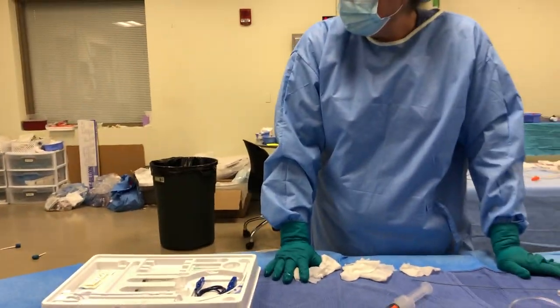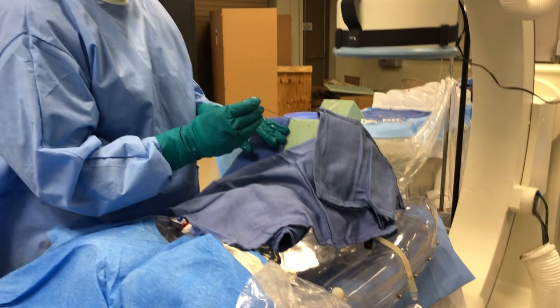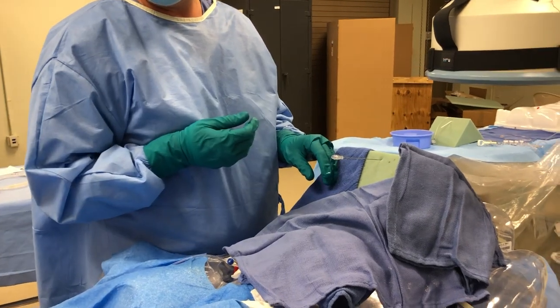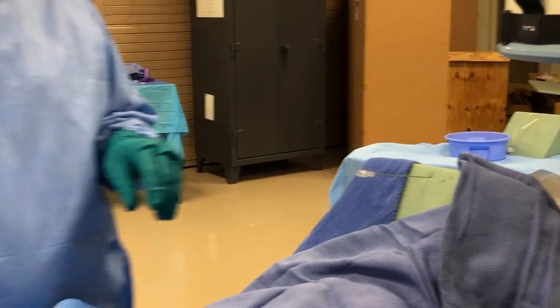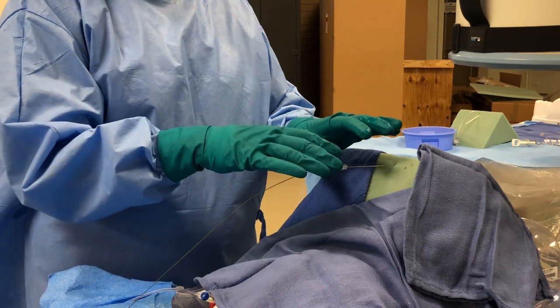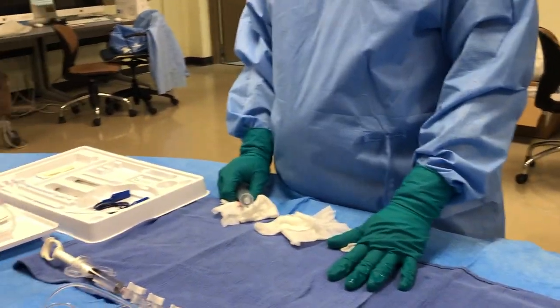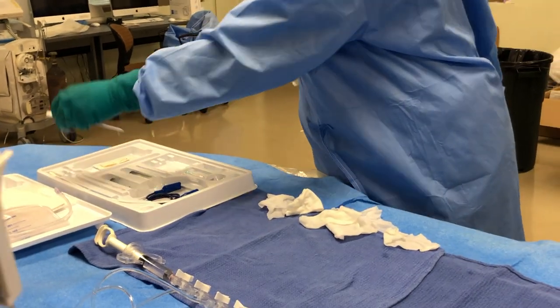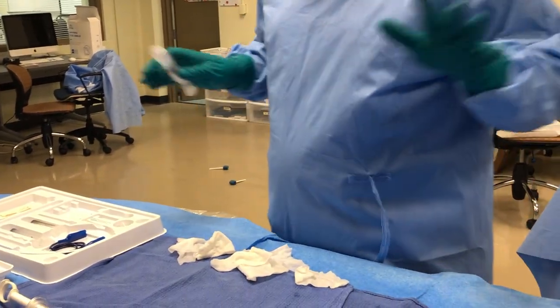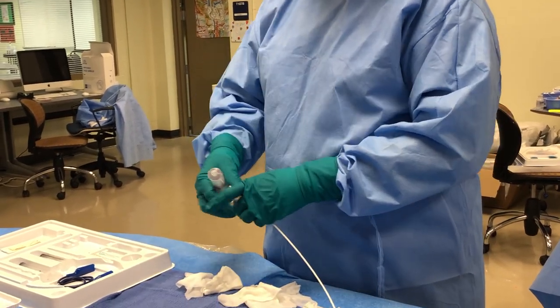The doctor is going to be up here starting to get access — they'll take their needle, poke it in, pull the stylet out, toss it down, and they'll need their wire ready to go. At the same time, I'm going to be down here getting the next items flushed and ready. The next thing we'll need is our tissue dilator, so I'll get it ready, and if I have enough time, I'll get my catheter prepped as well.